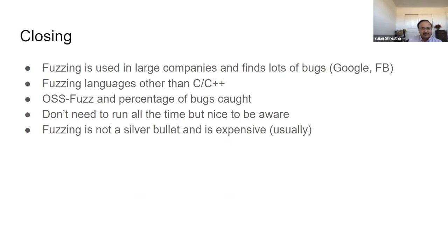And I'm thinking anything that's software level C could include things that are life critical, for example, the bug that you found with the infusion pump. There's probably some critical path there that, if a software unit was identified as being class C, on top of unit tests and all the other testing, you would also run fuzzing on that as well.